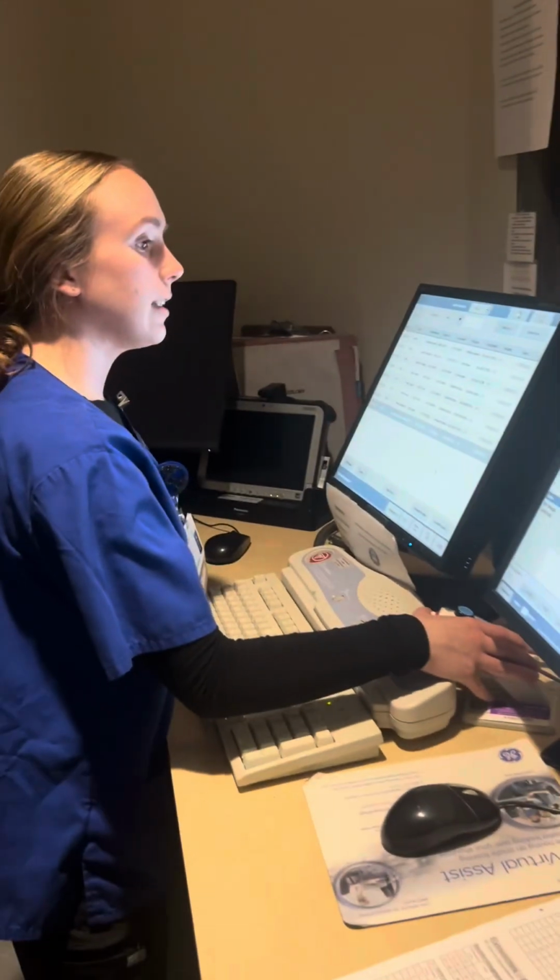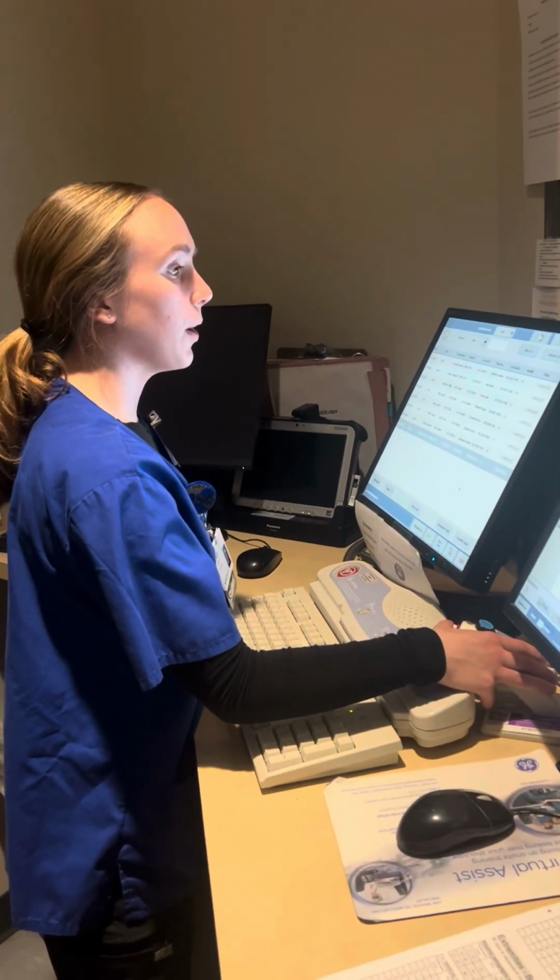All right, Lexi, lay still for me. Expose. When performing a tib-fib x-ray, some other factors that may be helpful is possibly turning the image receptor diagonally to better fit both ankle and knee joint on the image. You could also slightly increase the SID up to 48-50 SID, but typically if you are imaging an achondroplasia patient, because their limbs are a lot shorter than the average, there should be no issue at all getting both joints in.